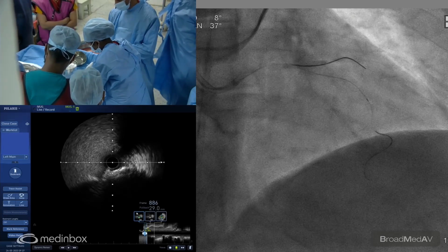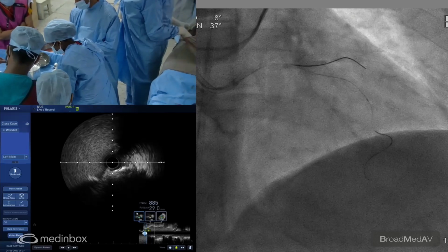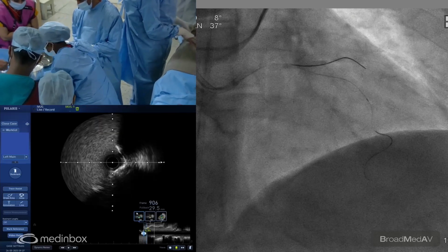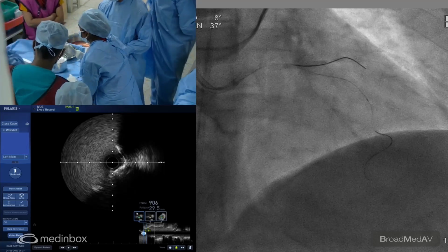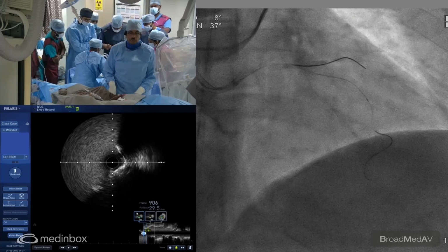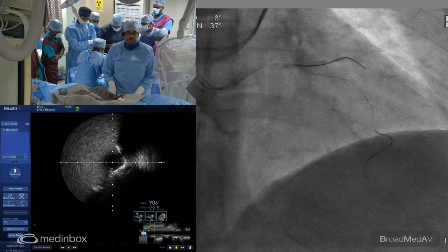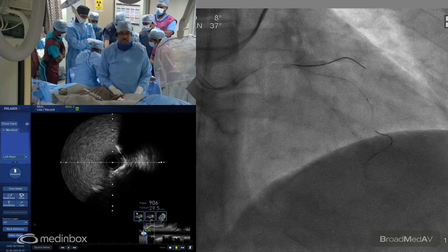As Dr. Nandakumar showed on the IVUS, there's not much disease at the distal left main or the proximal LAD. So we need to concentrate basically on the left main and deliver the maximum shocks there. Okay, and now can we go to the next slide, please?